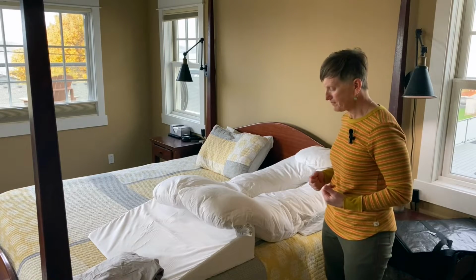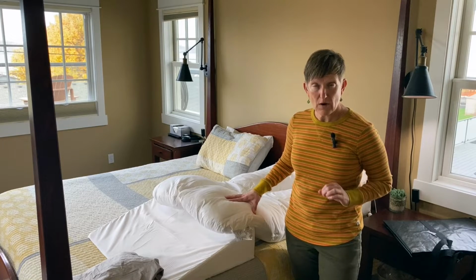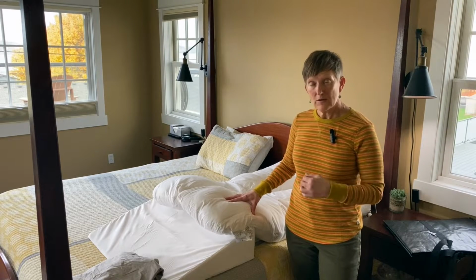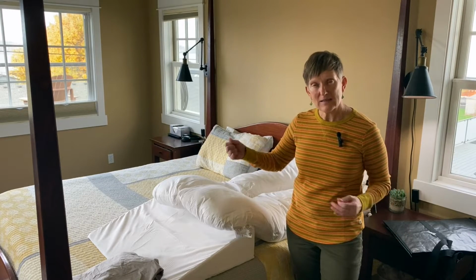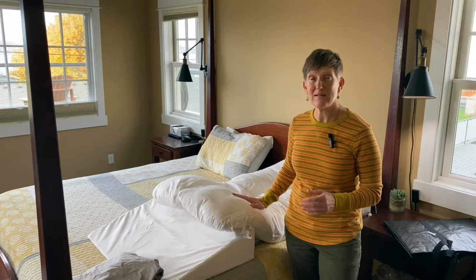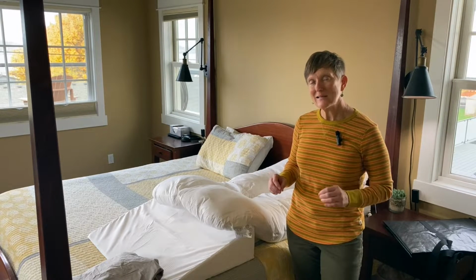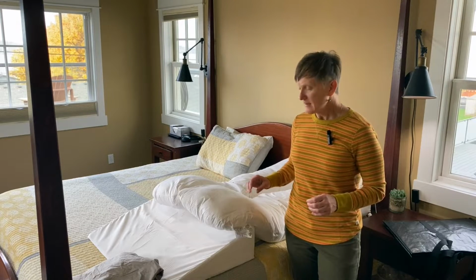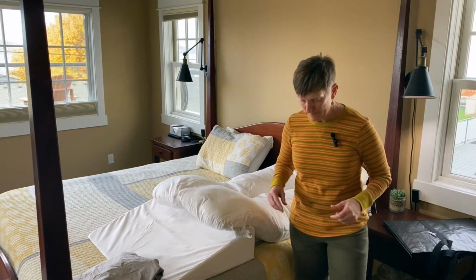If you purchase this, I would definitely recommend you get it way prior to your surgery so that you can take it out of the box, get it set up, get your fitted sheet on it, practice getting in and out prior to your surgery so that when you come home, maybe you're on some medication, you're a little uncomfortable, this is familiar, it's easy, and you already know how to do it. You might need a little assistance the first time or two, but it's actually pretty easy, and I think that you'll be able to get in and out on your own very quickly.